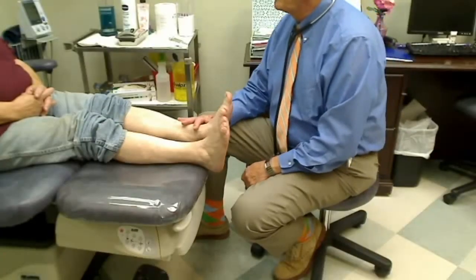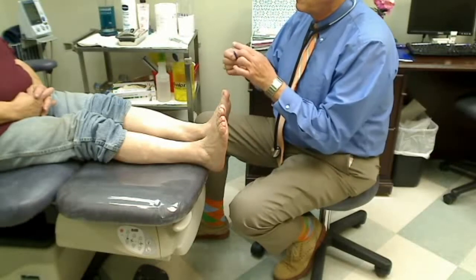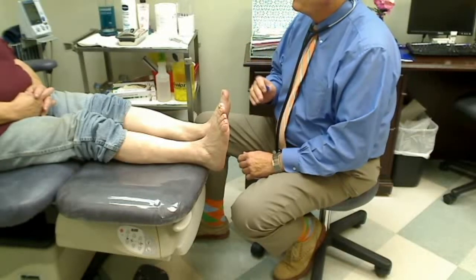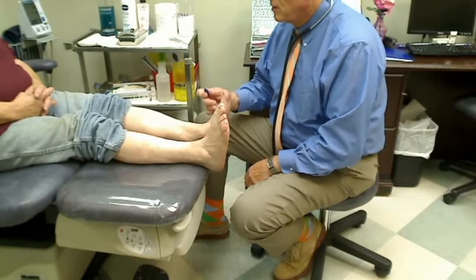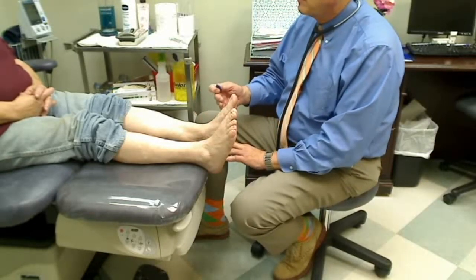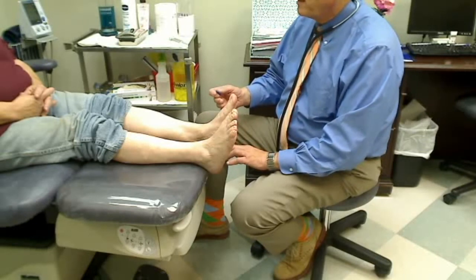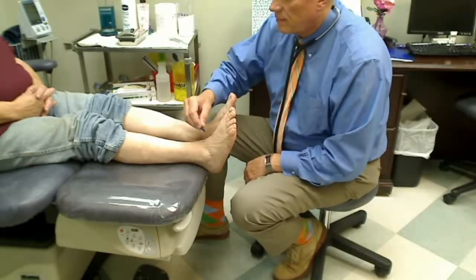Let's check sensation to your feet. And to do this, we're going to use a monofilament, which does not cause any pain. We're just going to touch it in several places on your feet to see if you have sensation. On the foot exam, we're going to check it on 2 places on the top and at least 5 on the bottom. But normally I'll check 3 on the toes, 3 on the ball, 2 in the middle foot, and 1 on the heel. So close your eyes and tell me if you can feel this.